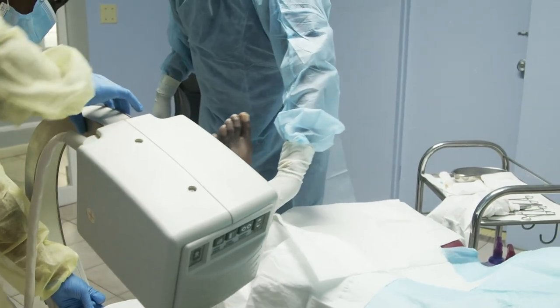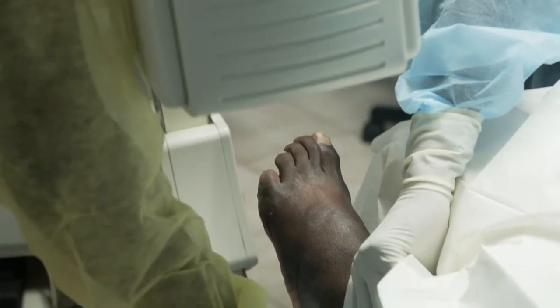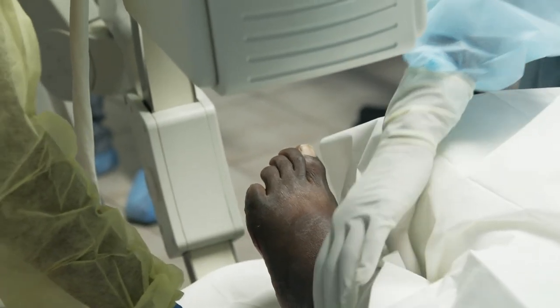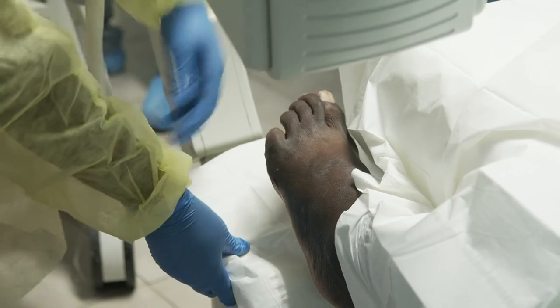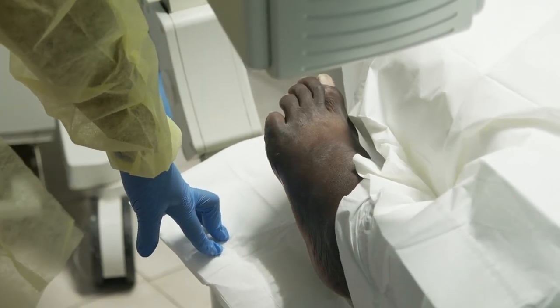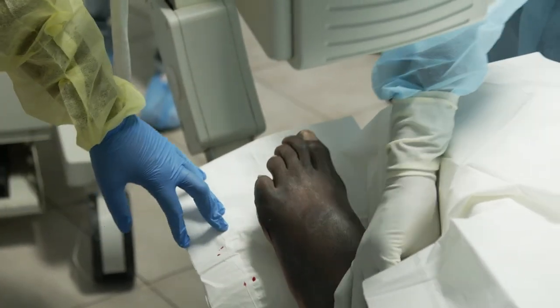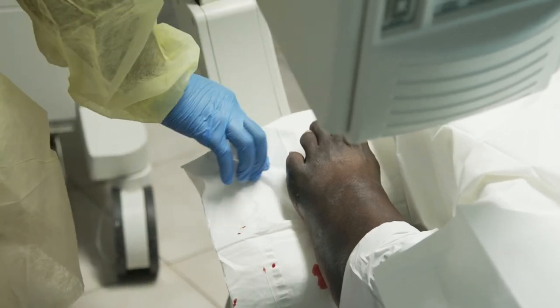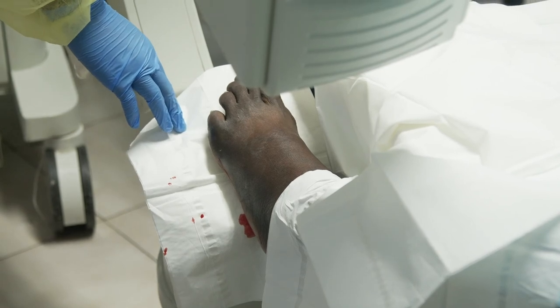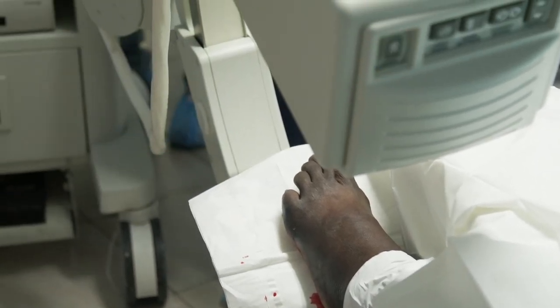Here we go. Bring your foot over. Put it down. Flat on this object. Down. Rest your foot down. We're going to come this way. This way. Come to you all. Right. You got to tilt it to him. Right. And then let the bed down. Get it flatter to him. Right. Right there. Ding. Okay. Gotta turn that on for me. Let's go. Shooting. Bingo, jingo.